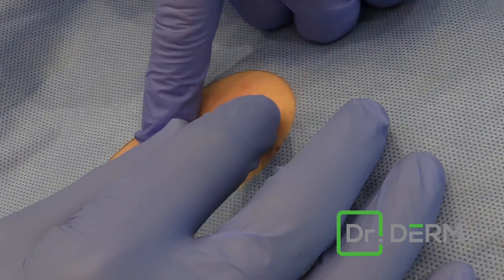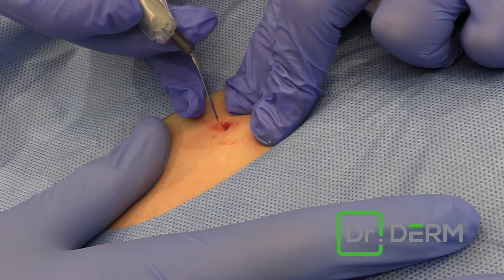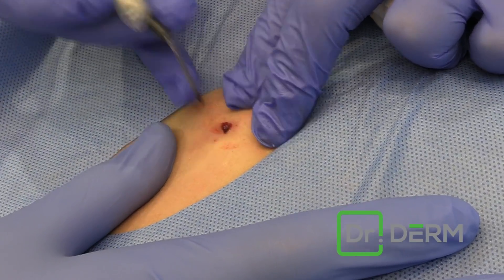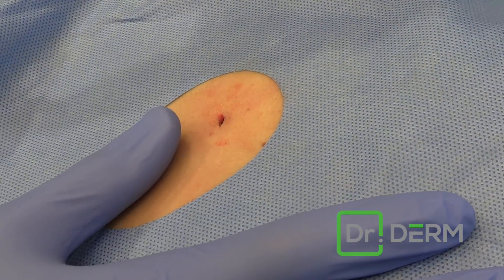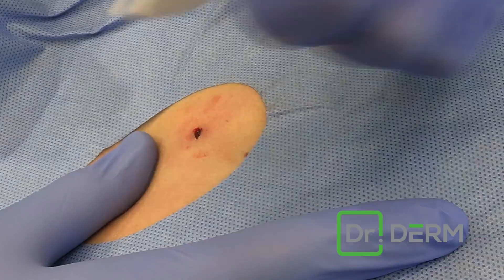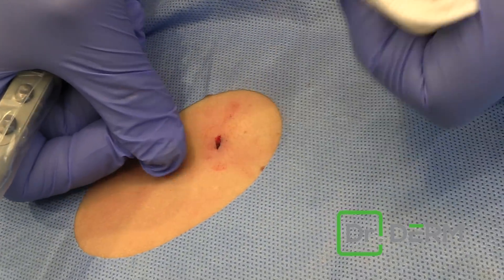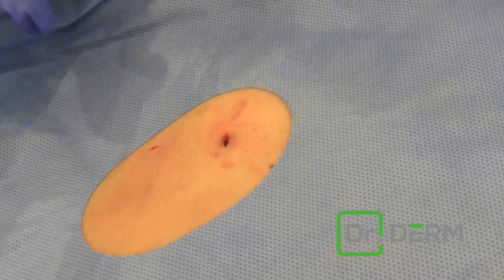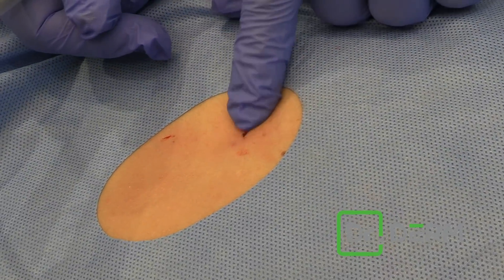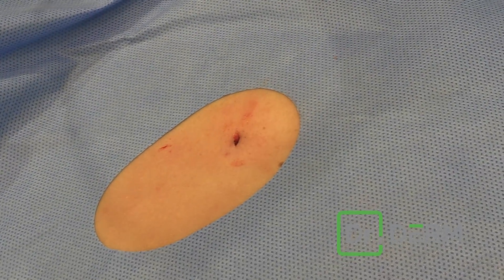So Brian, I'm going to have you kind of just pull down right there. And I'm just going to do this. I don't want to touch the skin edges, but I want to just get just enough heat in there to keep it from coming back. And that is perfect. That's it. We might put a little glue in that, but stitch or not, it's going to heal about the same — it's going to heal great. That heat just decreased the chance of it recurring.